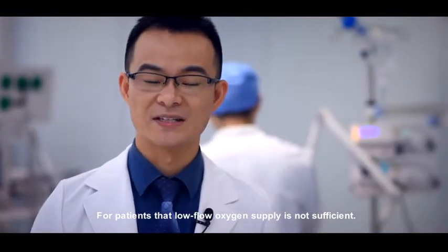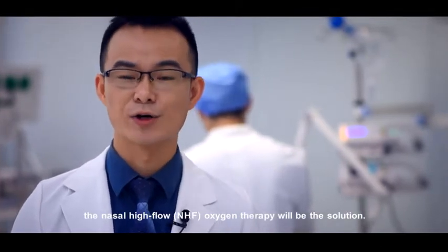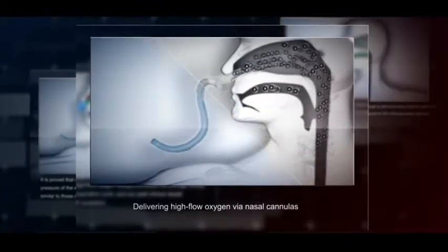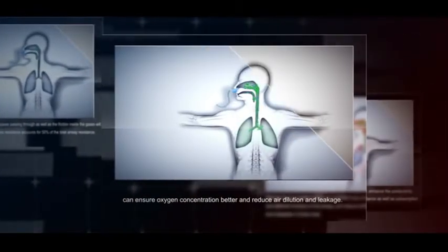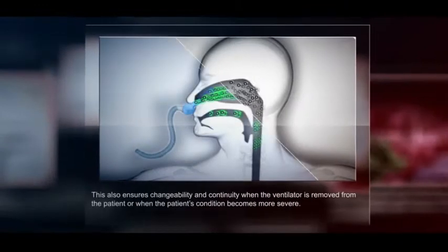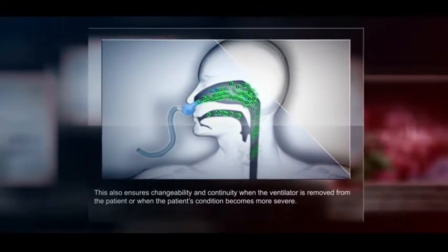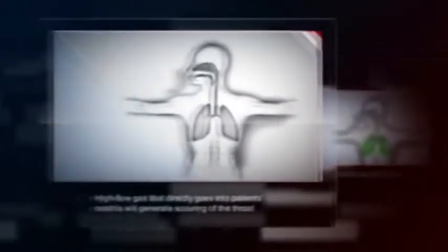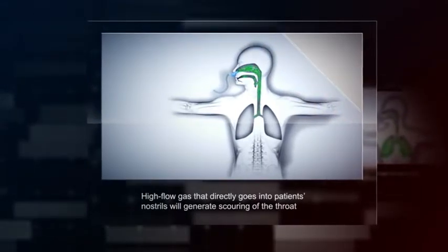For patients for whom low-flow oxygen supply is not sufficient, nasal high-flow (NHF) oxygen therapy will be the solution. Delivering high-flow oxygen via nasal cannulas can ensure oxygen concentration better and reduce air dilution and leakage. This also ensures changeability and continuity when the ventilator is removed from the patient, or when the patient's condition becomes more severe. High-flow gas that directly goes into the patient's nostrils will generate scouring of the throat.